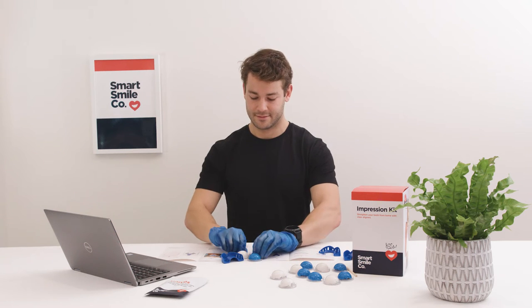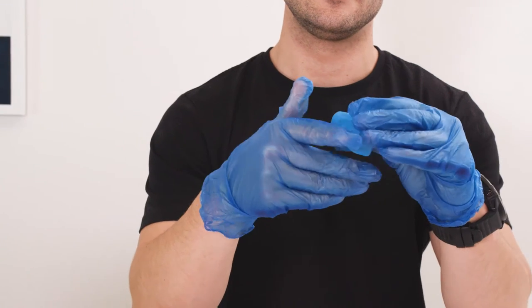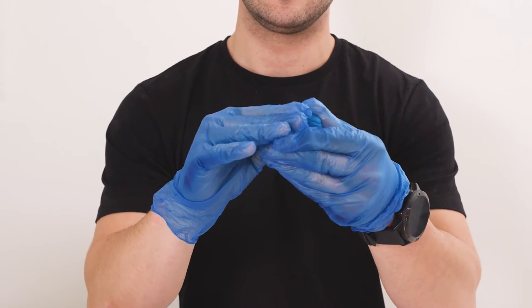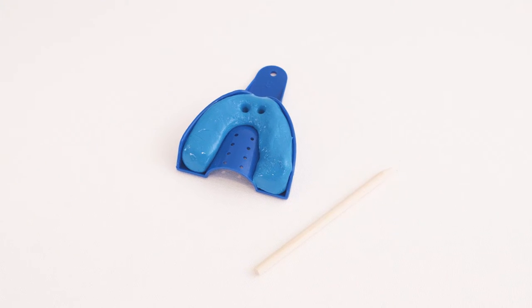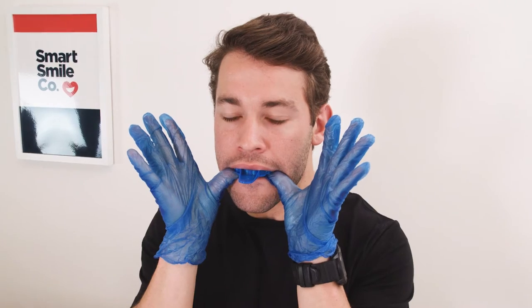Once you begin mixing the putty, you cannot stop and you must follow the timer on the screen. You'll have 30 seconds to mix the putty, 30 seconds to fit the putty in the tray, poke guide holes and begin the impression, then three and a half minutes to hold the impression in place.